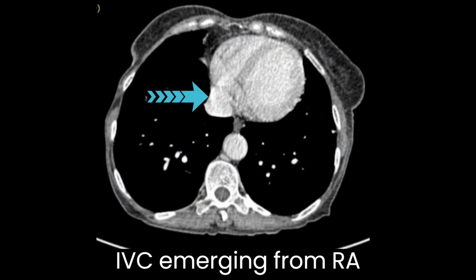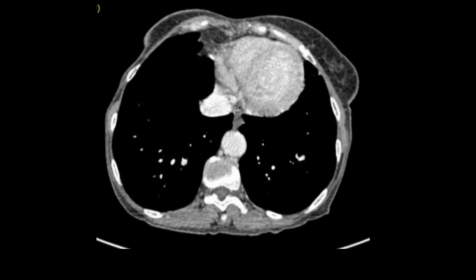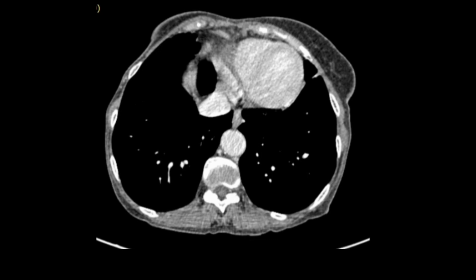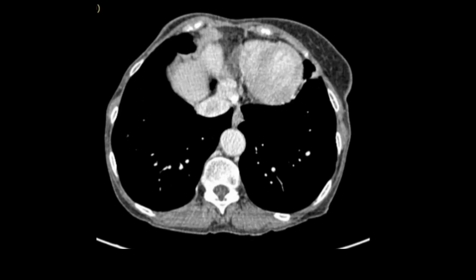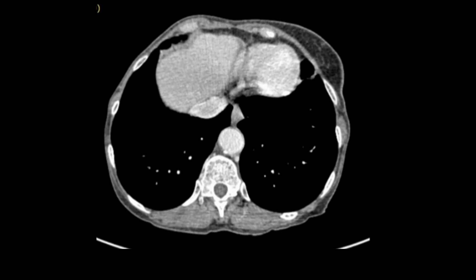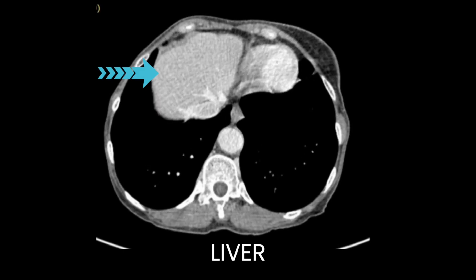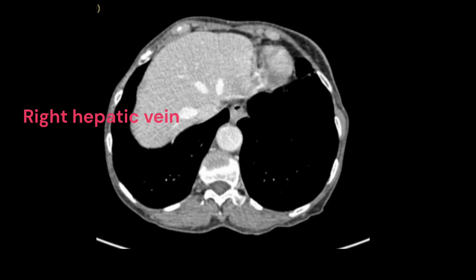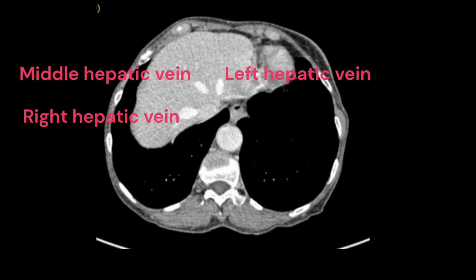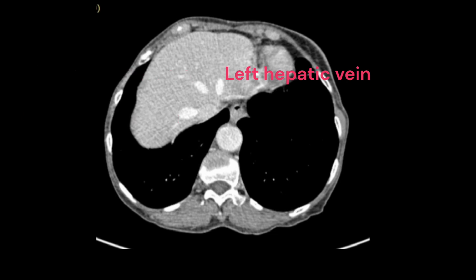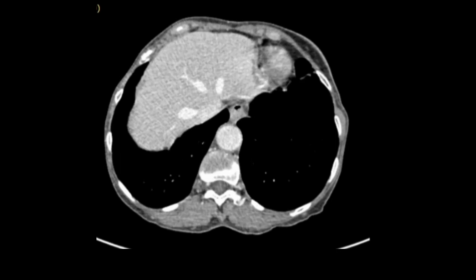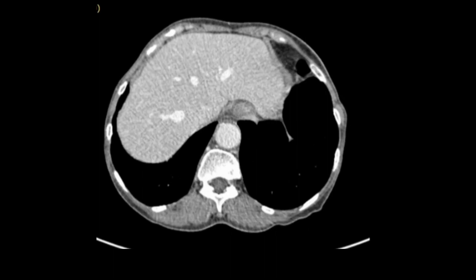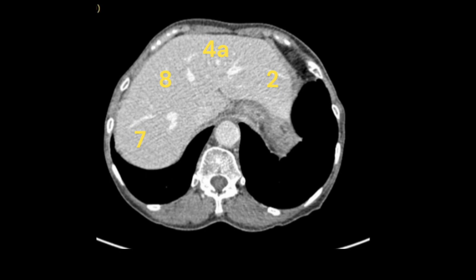On CT, we can see the IVC emerging from the right atrium. Trace the IVC downwards to see the convergence of the three hepatic veins. After the diaphragm ends, as we move down, we can see the right hepatic vein, middle hepatic vein, and left hepatic vein draining into the IVC. We trace along the middle hepatic vein to divide the liver into right and left.